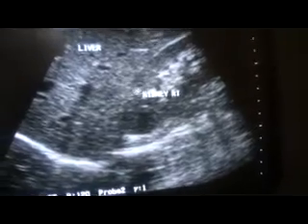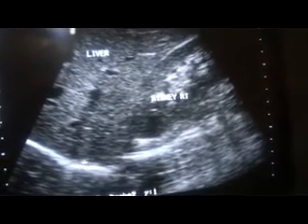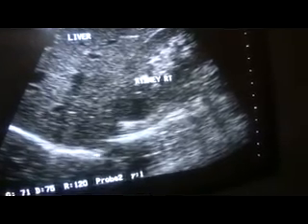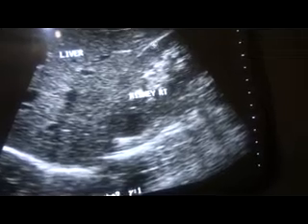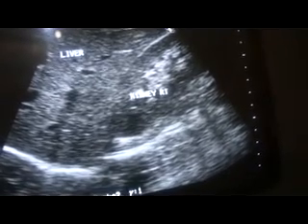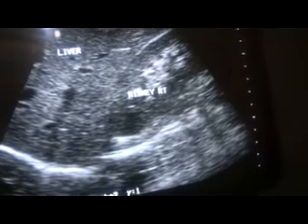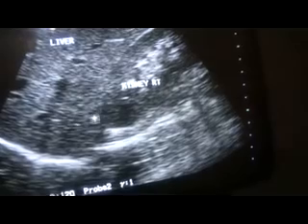The black area or hypoechoic area below the capsule — this is the capsule of the kidney. And the relatively hypoechoic area, this is the parenchyma. The bright echogenic area seen in the center is the central sinus echocomplex. It is echogenic because it contains fat. This is also called the collecting system.